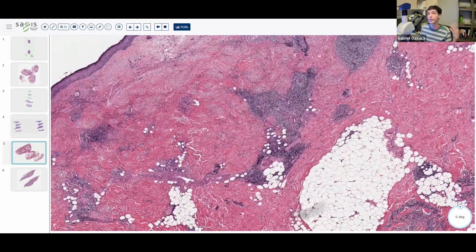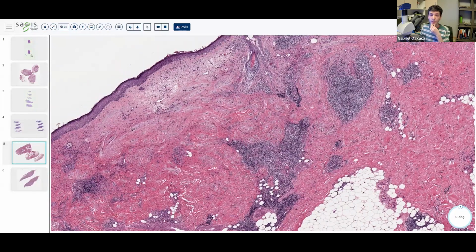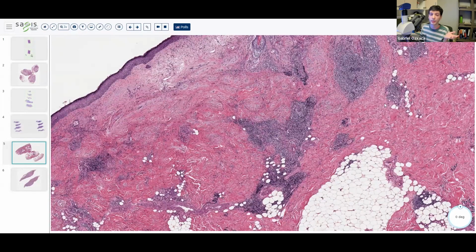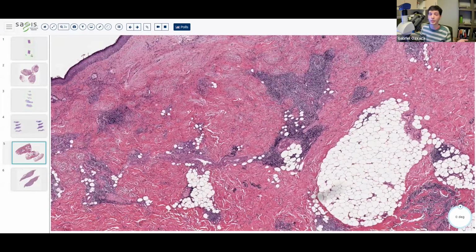Because of this, and there are some other instances where melanoma, particularly in cases where it's very poorly differentiated, may lose its melanocyte-specific markers. SOX10 and S100 are typically the best markers for getting something in the melanocytic camp. And then you might ask, well, isn't that the same as neural? And the answer is yes, it is. But in this clinical context and with the MIS overlying the lesion, there is no way that this could possibly be a neurofibroma or some other neural tumor.